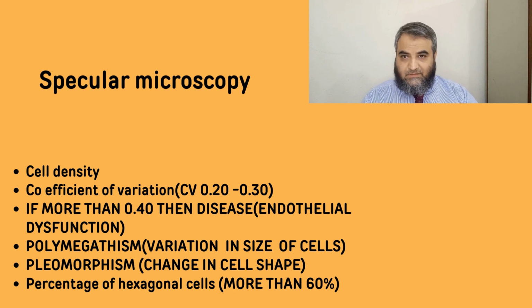Proper use of these viscoelastics, which I told you earlier, and the selection of the surgeon. These patients need expert hands who can manage in minimum phaco time and minimum phaco energy, who can deliver the results.